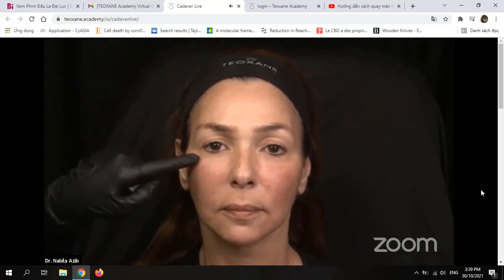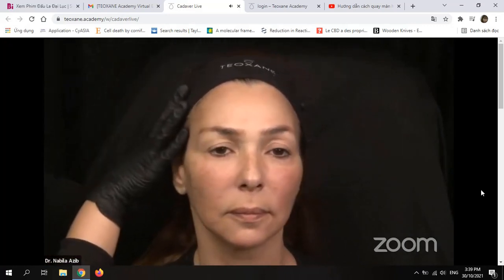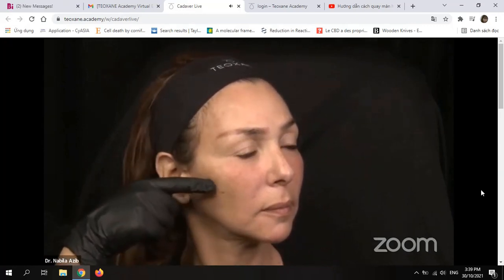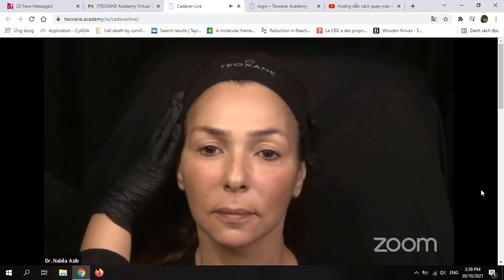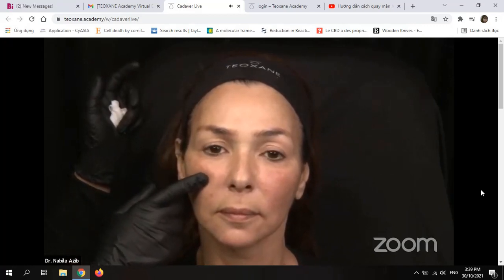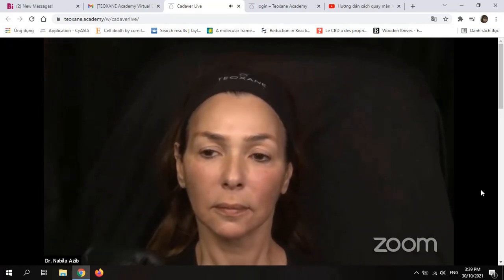Also, the tear trough is less apparent than on the other side. And if I show you the patient in the 3/4 view, yes, you can see that we achieve a highlight effect in the lateral cheekbone. But it's not finished, because we need also to lift a little bit more and to get a high definition of her mid-face with RHA4 from the same entry point.